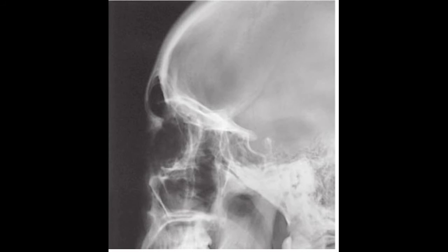The next image that I took of Sky was the lateral projection of the paranasal sinuses. This projection does show all 4 sinus groups. That's the main objective of this projection. They had proper collimation. You can see that the sphenoidal sinus is the best demonstrated out of all of them.